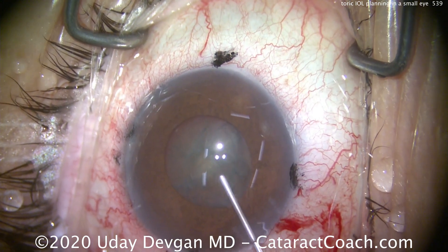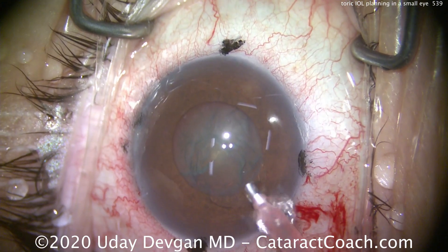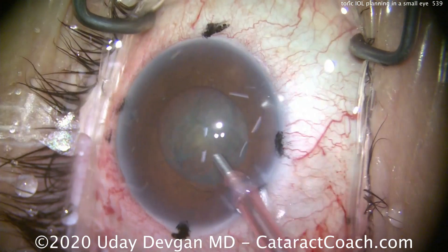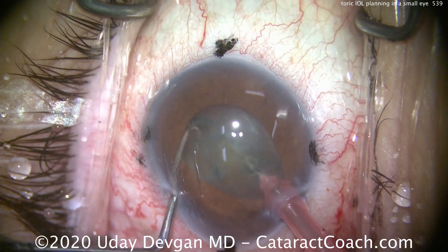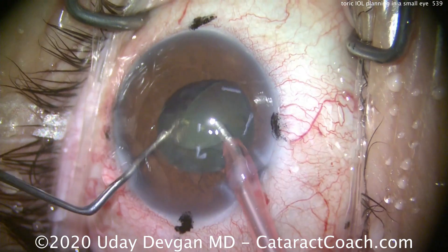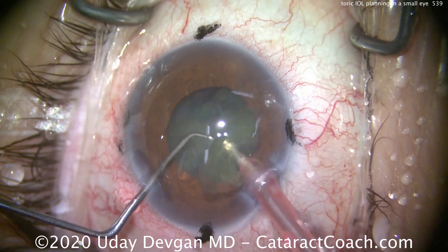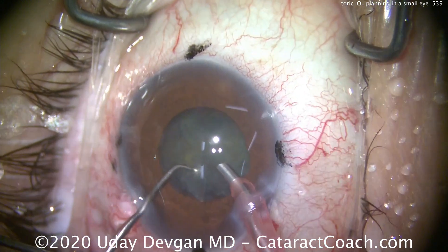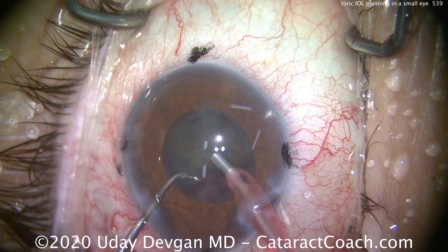The nucleus is hydrodissected. A little more viscoelastic to protect that central corneal endothelium. Here comes the phaco sleeve and phaco tip, and we're going to use our chopper. We're not going to prolapse the nucleus — there's just not enough room in the anterior chamber. So we'll buzz in with the phaco probe, the chopper goes in, and we separate the nucleus and chop it into two halves. We bring the first half up to the iris plane and emulsify it slowly, staying in the center, away from the endothelium. Then the second half of the nucleus comes up as well.